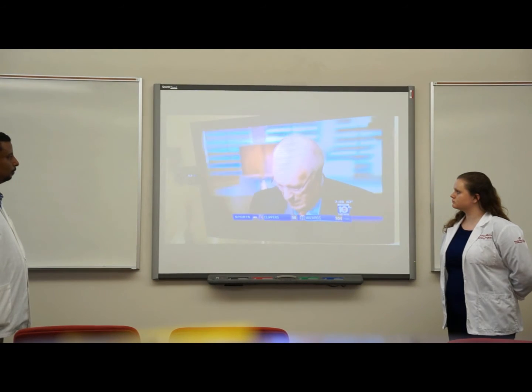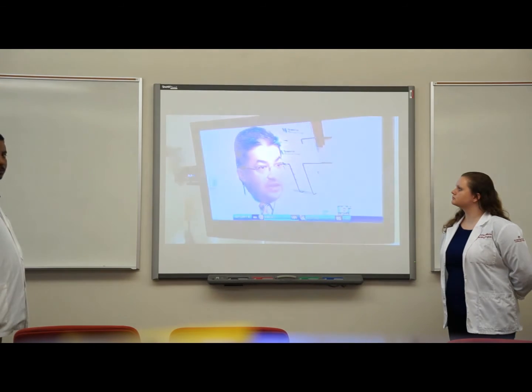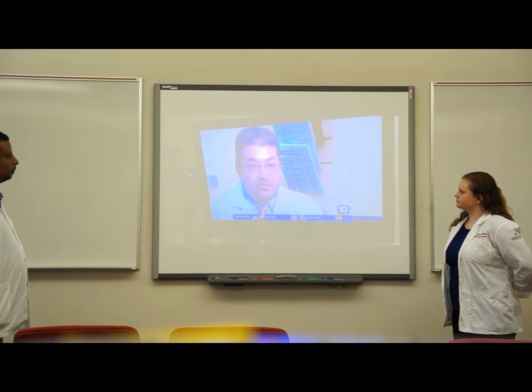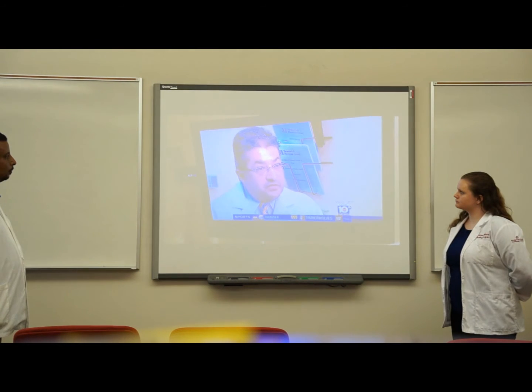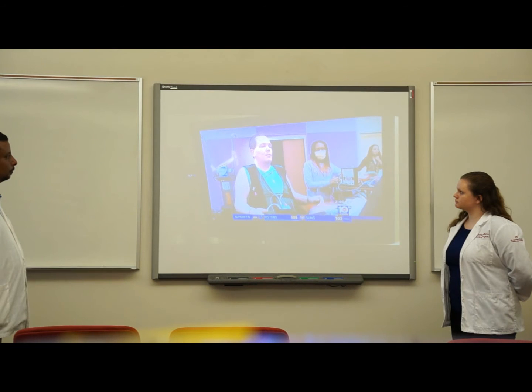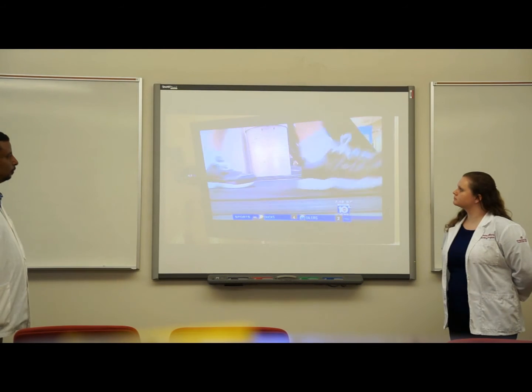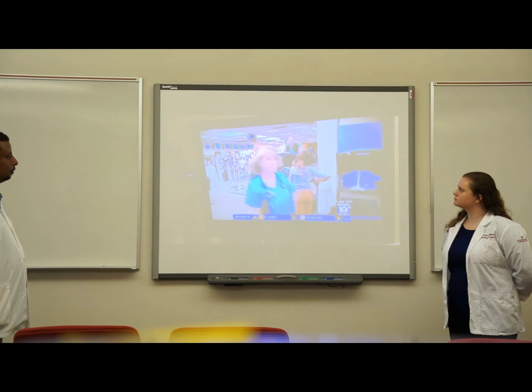The Lvad is what kept Vice President Dick Cheney alive until he got his transplant. In some patients, the device is used as what we call destination therapy, which means lifelong support. But for some other patients, this device is used as a bridge to transplantation. The Lvad turned into an unexpected second chance for Ken. He began to lose weight and exercise under the watchful eye of medical support. So far, he's down 80 pounds, and now he is healthy enough for that transplant.